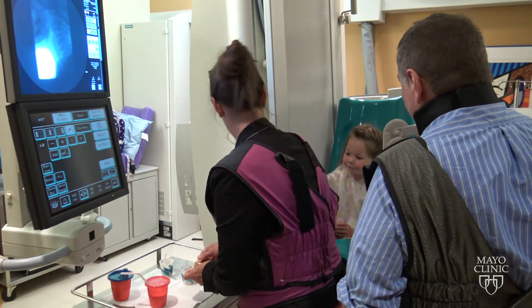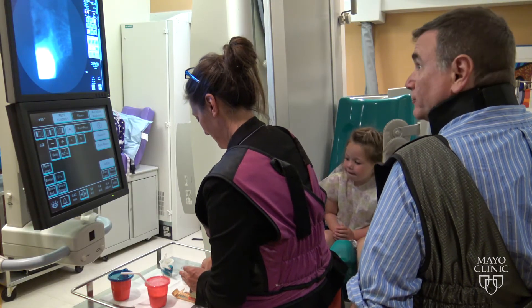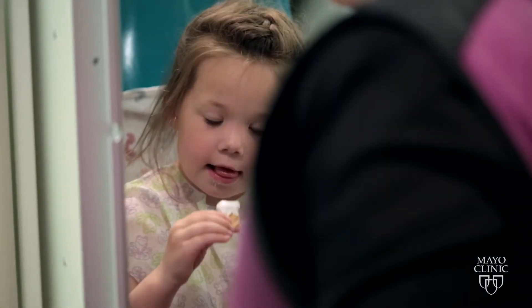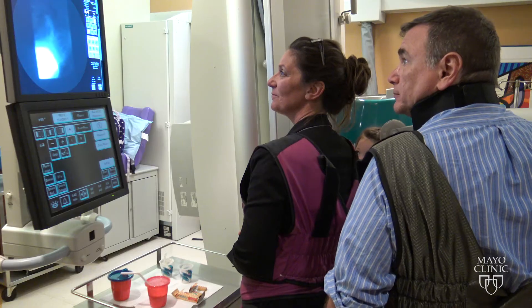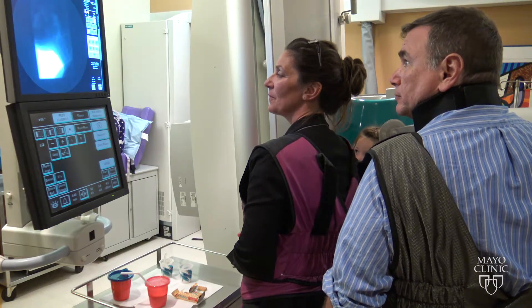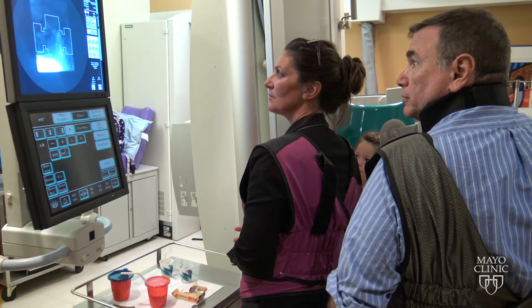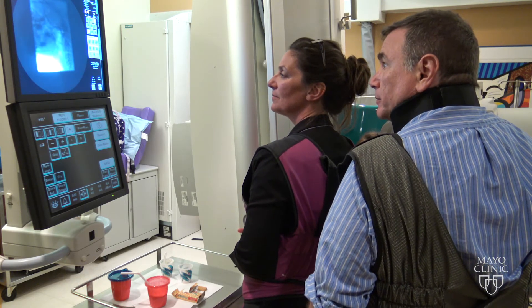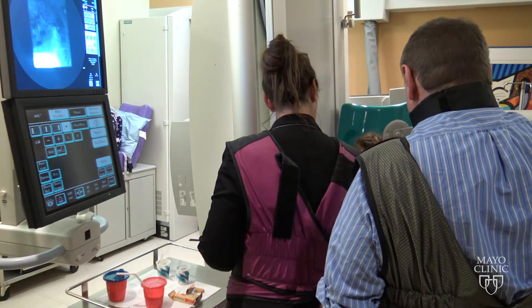Do you want to try a cookie? All right. There you go. You can take a bite of that for me and chew that up. Good job. All right. There you go. Very nice! Good work!